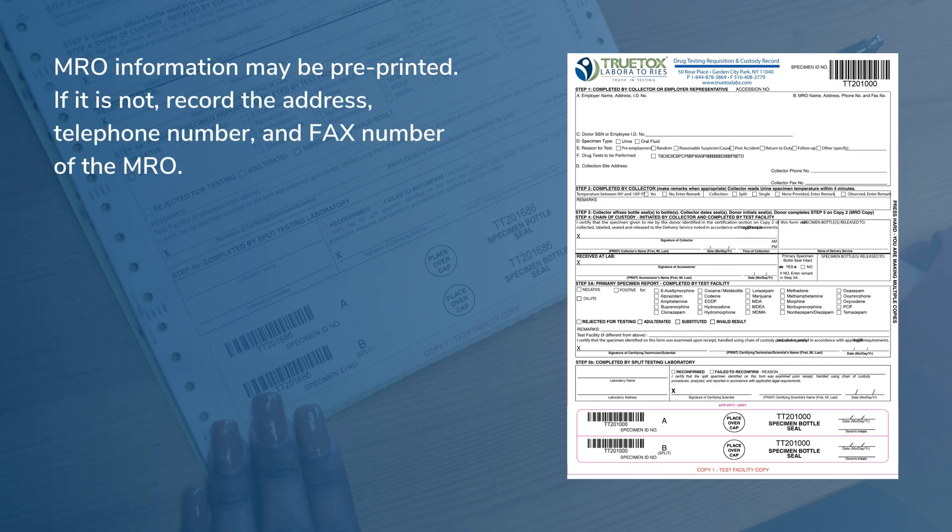And provide MRO information. The MRO information may be pre-printed. If it isn't, record the address, telephone number, and fax number of the MRO.